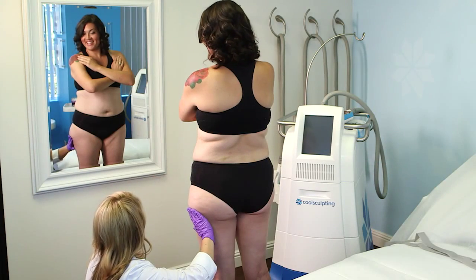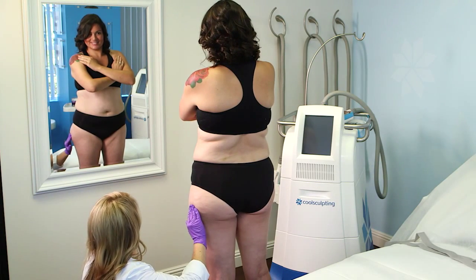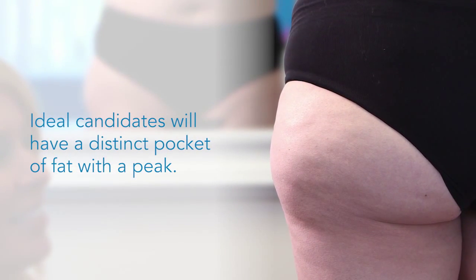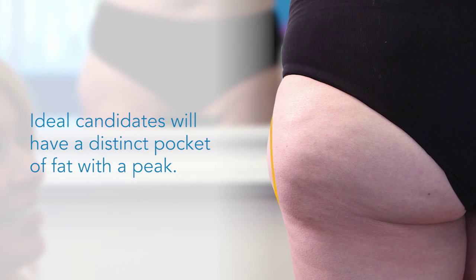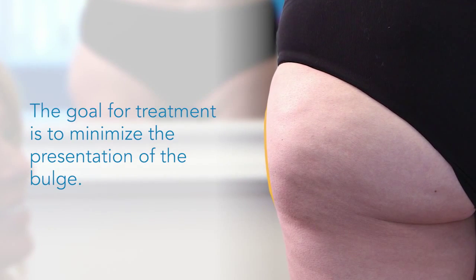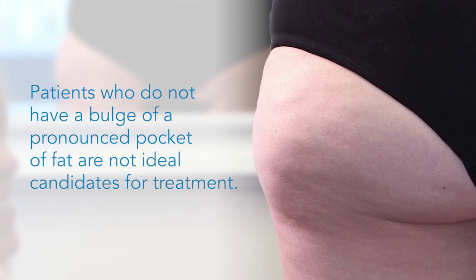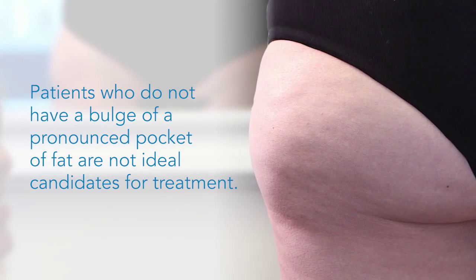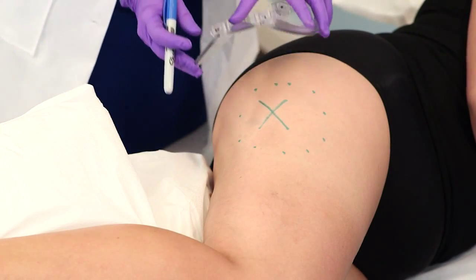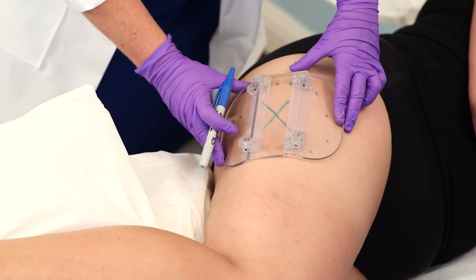Patient selection and assessment are essential to ensuring consistent and aesthetically pleasing outcomes. Ideal candidates for treatment of the outer thigh have a distinct pocket of fat with a peak. The goal for treatment is to minimize the presentation of the bulge. Patients who do not have a bulge or a pronounced pocket of fat are not ideal candidates. Use the CoolSmooth applicator planning template to ensure the cooling panels make complete contact with the skin.